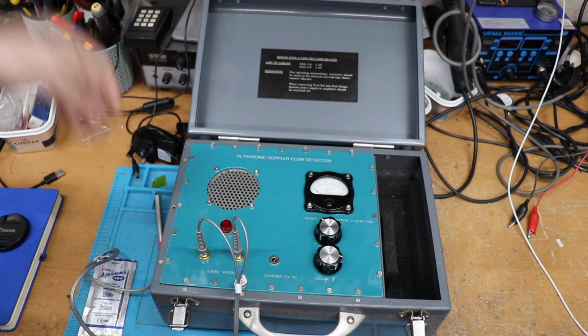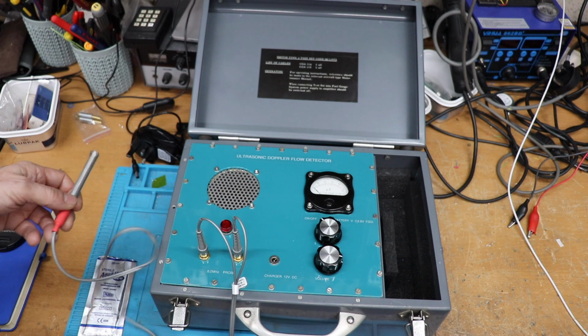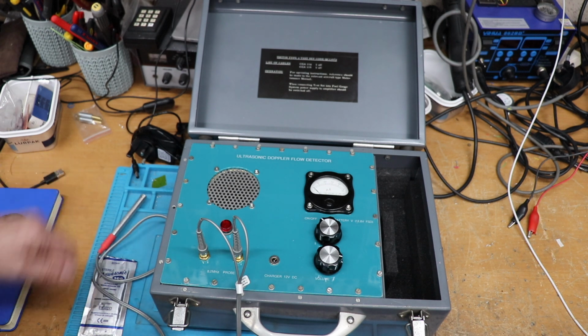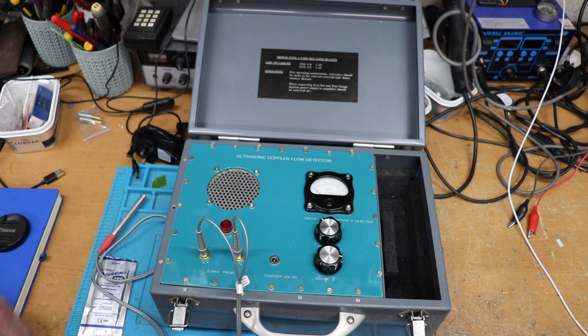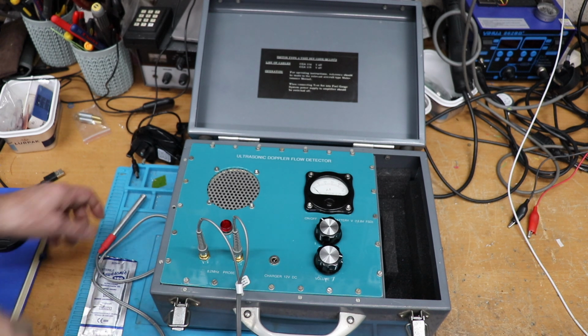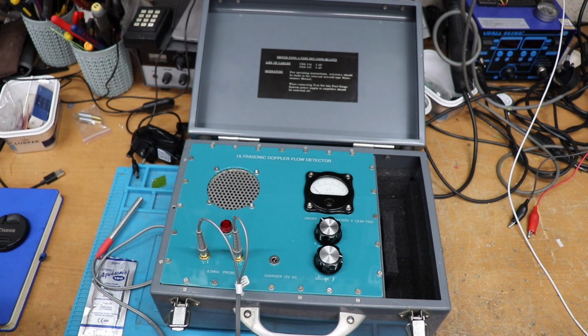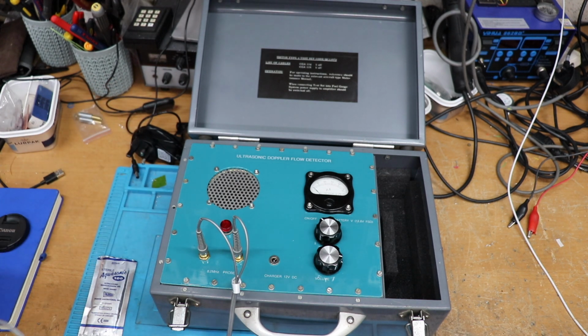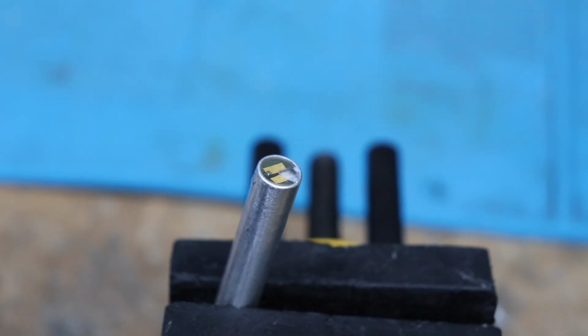Anyhow, let's take a look at this probe a minute. This probe's quite interesting. Hopefully we'll get some up-close shots of this, because then you can see exactly how it's made, and figure out the transmitter and receiving crystals that are in this probe, which you can actually see because of the way this one's made. Okay, so we've got the probe just lightly clamped in the vise, just to keep it steady. There's not much to these actually. It's just a piece of aluminium tubing, and at the end of it you've got two crystals.